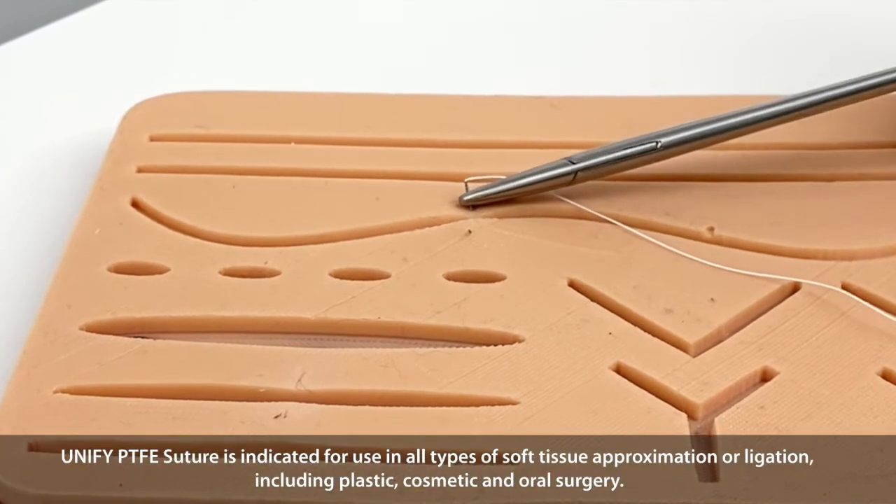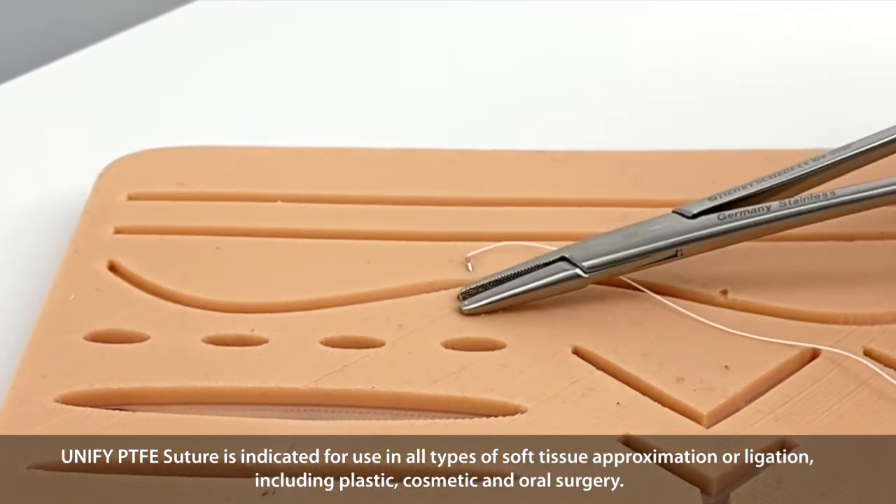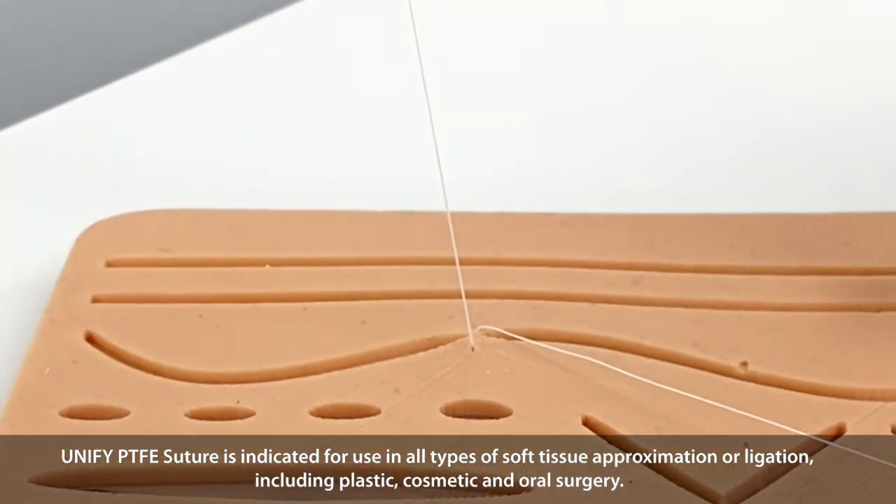Unified PTFE Suture is indicated for use in all types of soft tissue approximation or ligation, including plastic, cosmetic, or oral surgery.